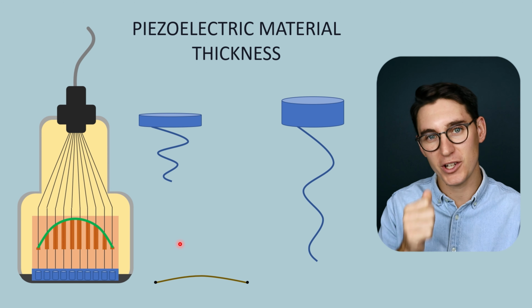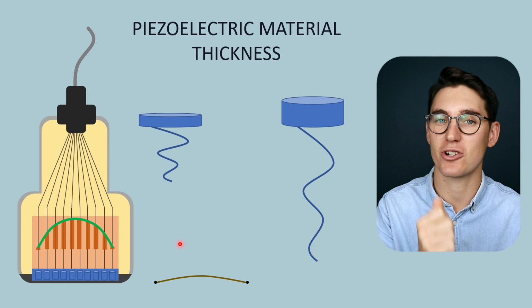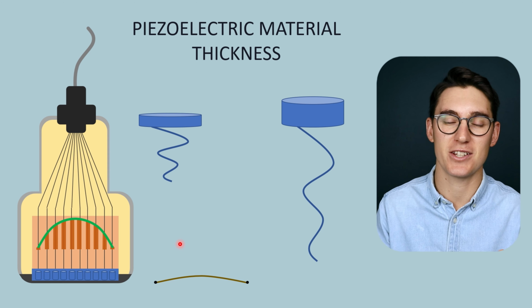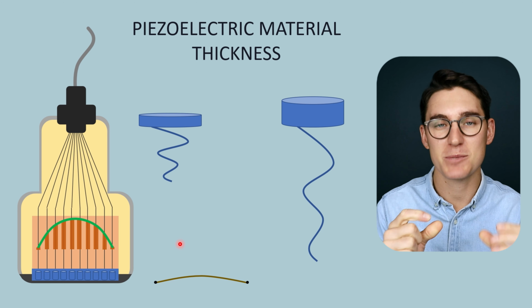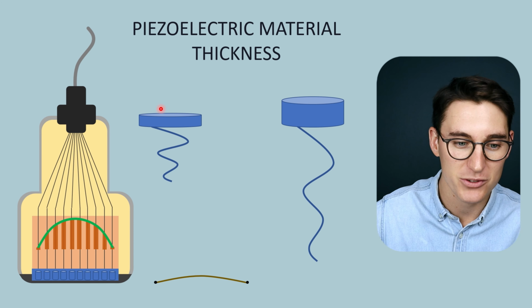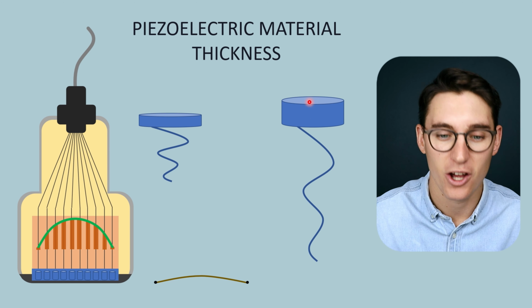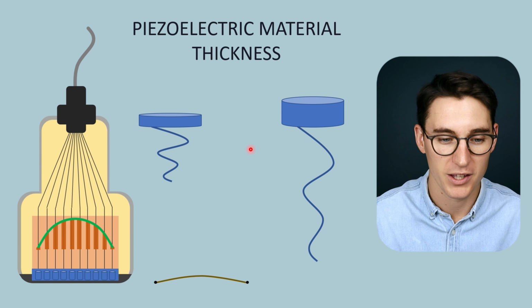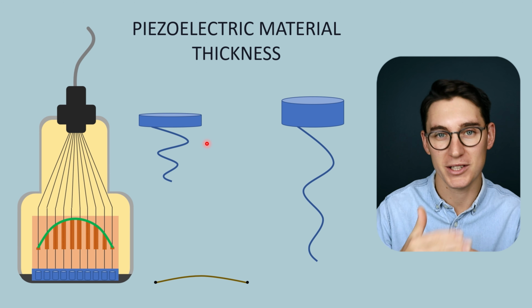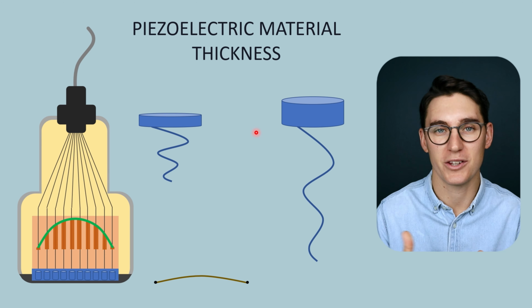Now I've mentioned that frequency is something that is controlled by the ultrasound transducer, and a specific transducer has a specific frequency. We can't easily go and change the frequency of that transducer. And that's because frequency is determined by two things. It's determined by the speed of sound through our piezoelectric material, and it's determined by the thickness of that piezoelectric material. The thinner a piezoelectric material, the higher the frequency that will be emitted from the ultrasound machine. The thicker the material, the lower the frequency.